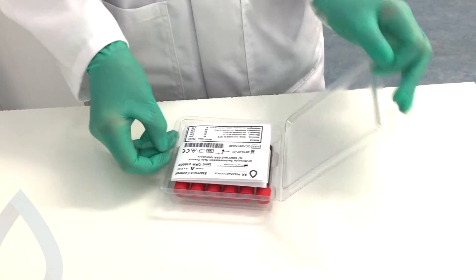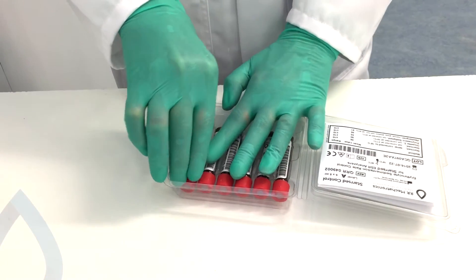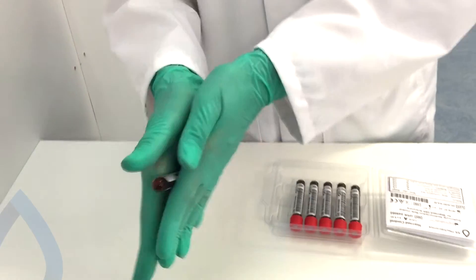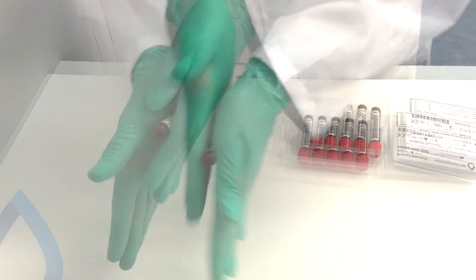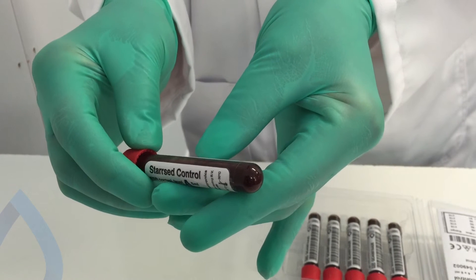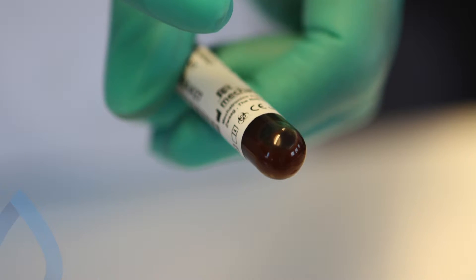Open the blister and pick one tube. Please pay attention to the expiry date. Roll Star Z control with the cap downwards between your hands until the air bubble moves freely through the tube and no cells stick to the bottom or top of the tube.